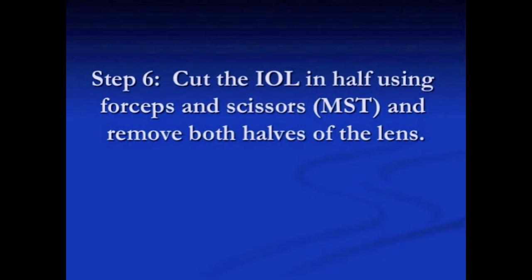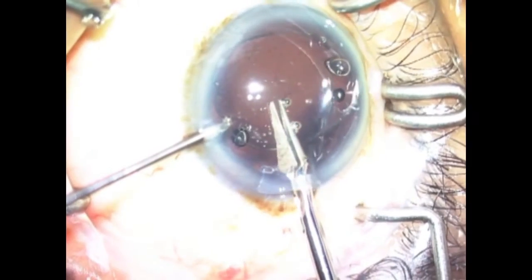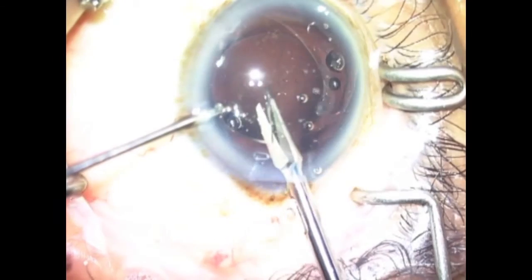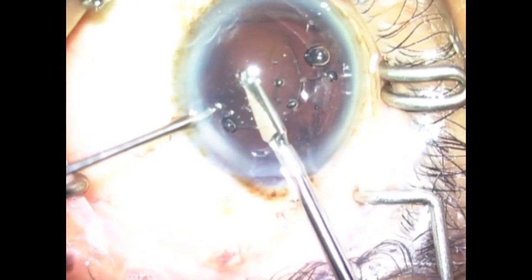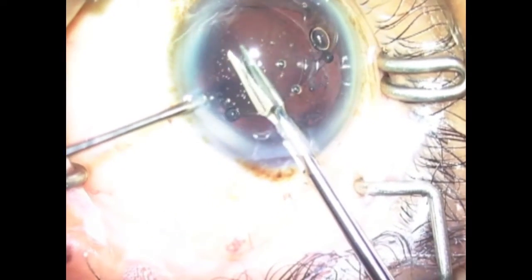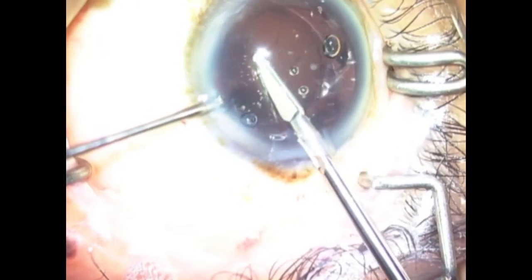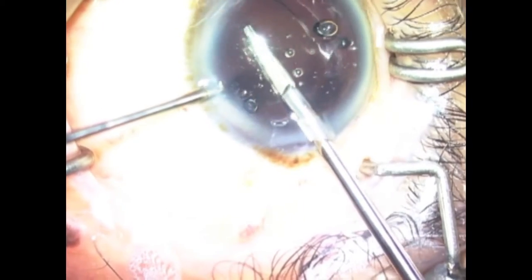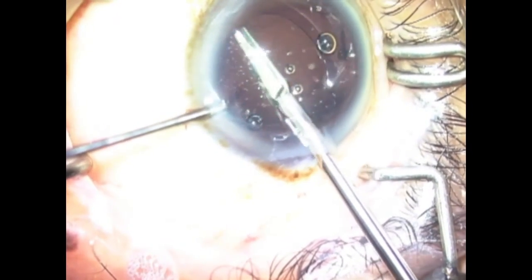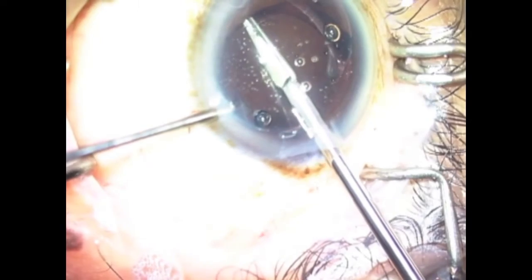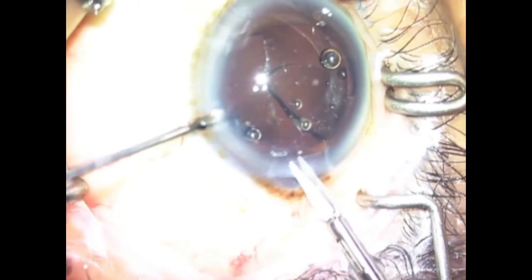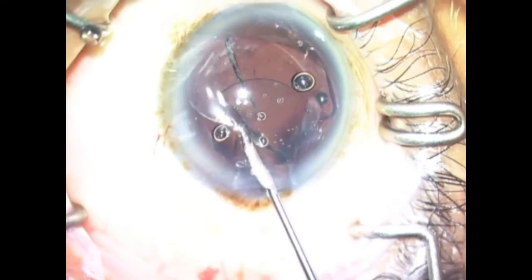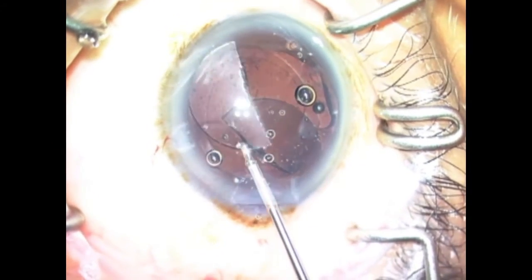Cut the intraocular lens in half using MST forceps and scissors. Several small bites are taken with the scissors to complete cutting the intraocular lens in half. Both halves of the intraocular lens are then removed with forceps.